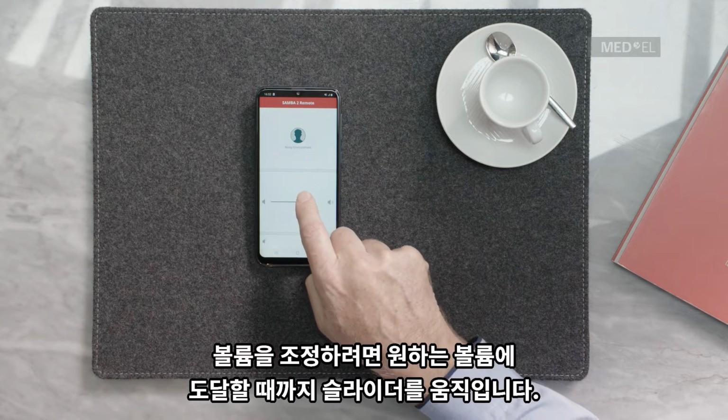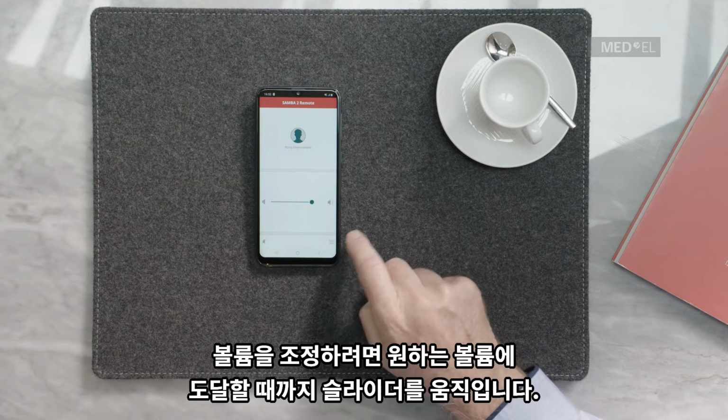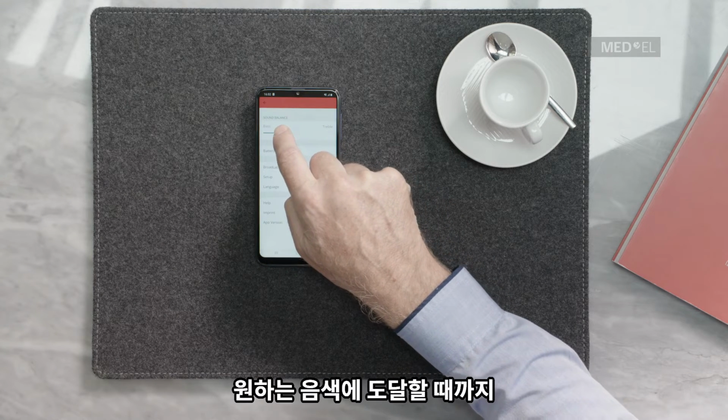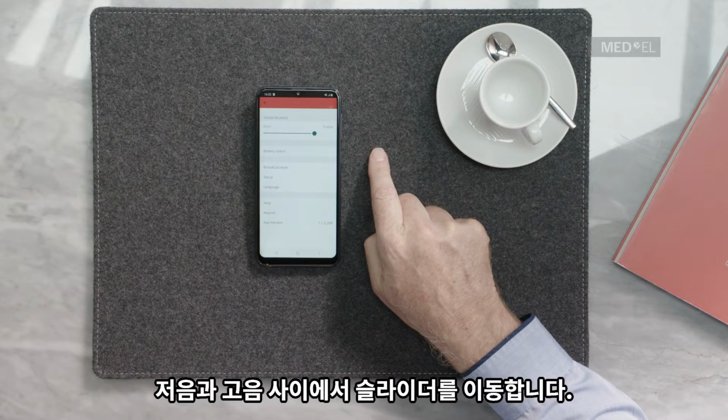To adjust the volume, simply move the slider until the desired volume is reached. To adjust the timbre of the sound, click on the menu button in the bottom right. Move the slider between bass and treble until the desired timbre is reached.